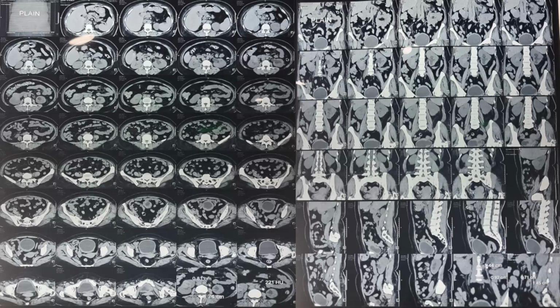PUJ calculus is mentioned. Yes, this is very obvious. It can be seen in the third row. Sorry, I missed it. Yes, sir, second and third, I can see a stone. In exam or in real life, you should not miss these things. Where the USG report clearly writes about the stone, and on CT scan, if you are not able to see it though it is visible, it is not right. Okay, sir. Go ahead.